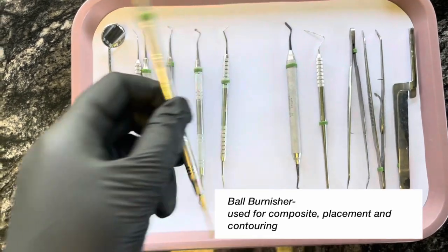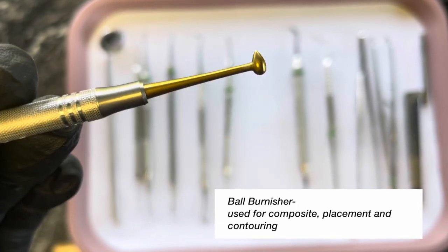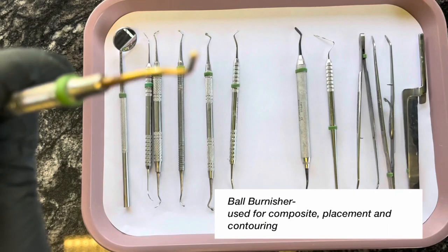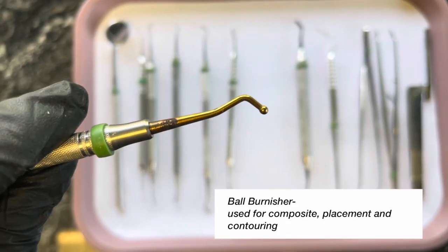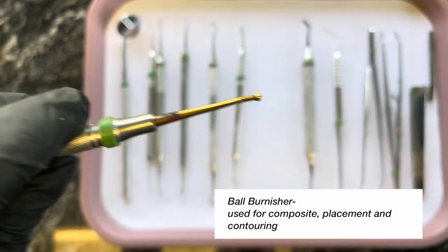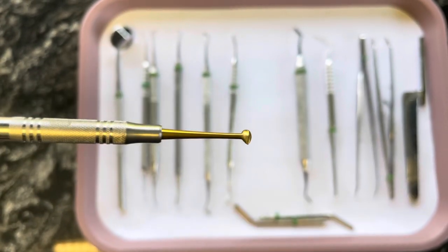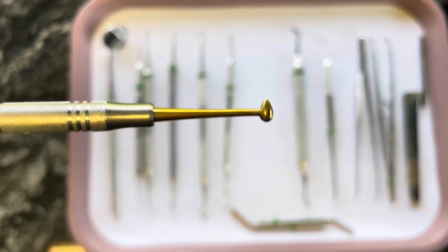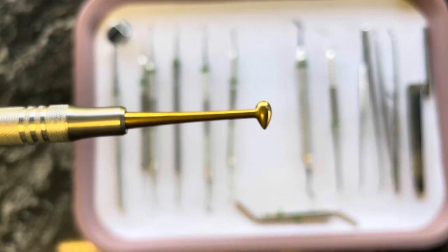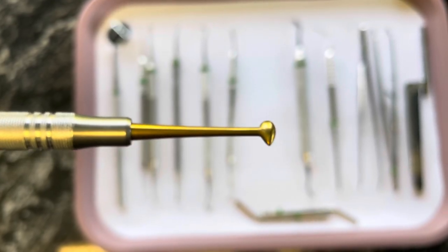Next we have a ball burnisher. It looks like a football on one side, and then the other side is just a round ball. And this is used to smooth out the composite. You can also use this as a condenser as well. I like to use this with some bonding agent and just smooth out my composites.